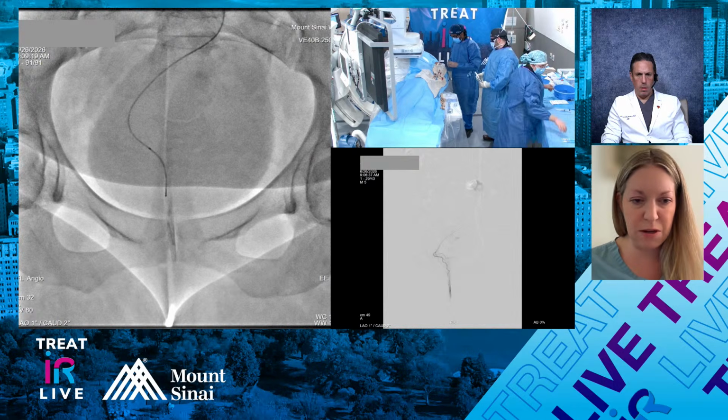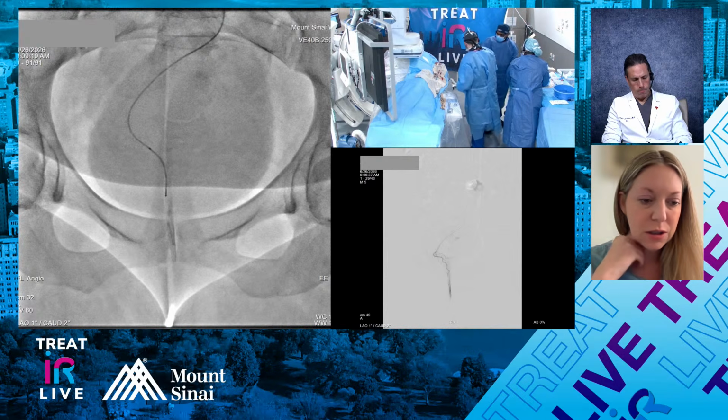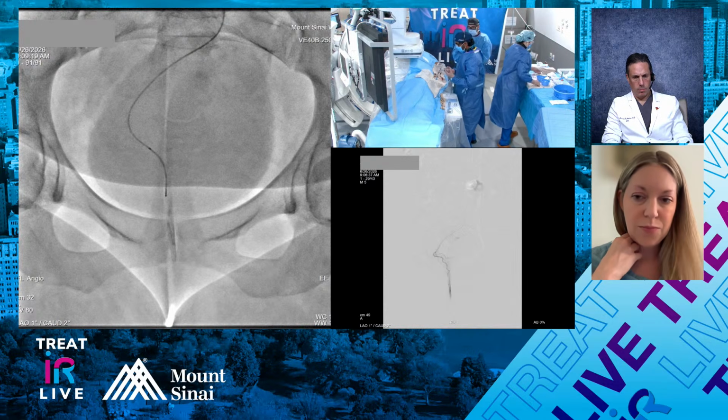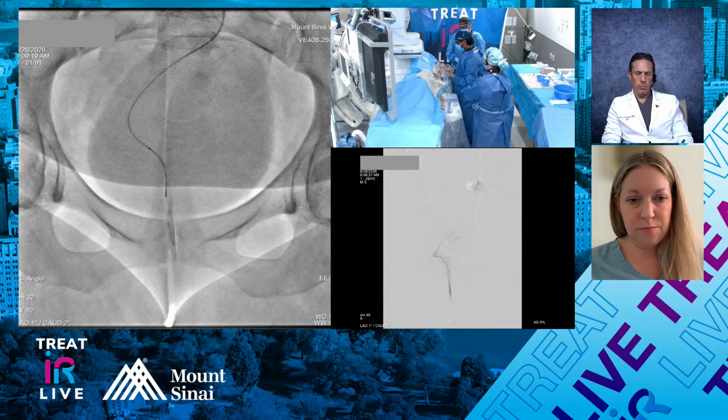You know, as you move it up, sometimes you're not going to find the particles much farther than that. So hopefully it's not too early here. Where are the particles? Yeah. These vessels to me are more prone to spasm than any other vessel that I routinely select. So I have nitro on the table ready. Fortunately, I'm not going to give it now because I feel like we don't need to.